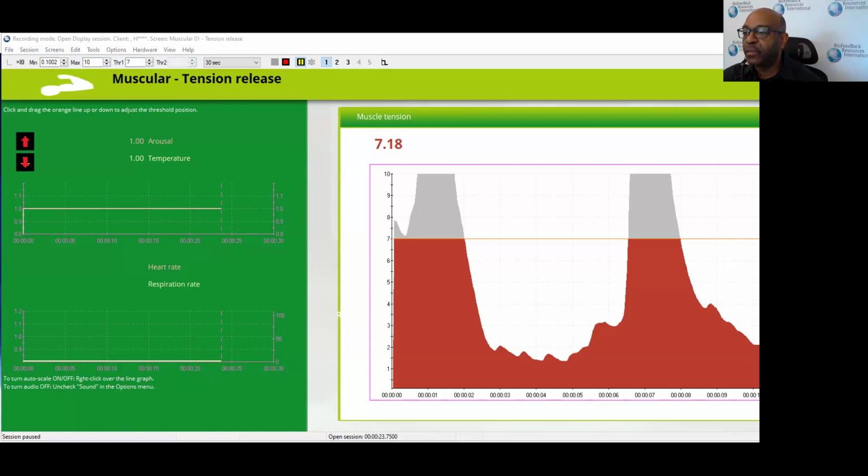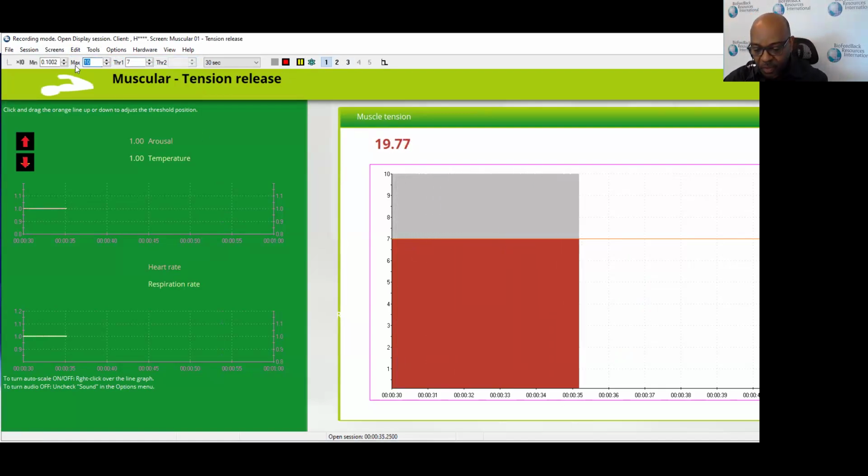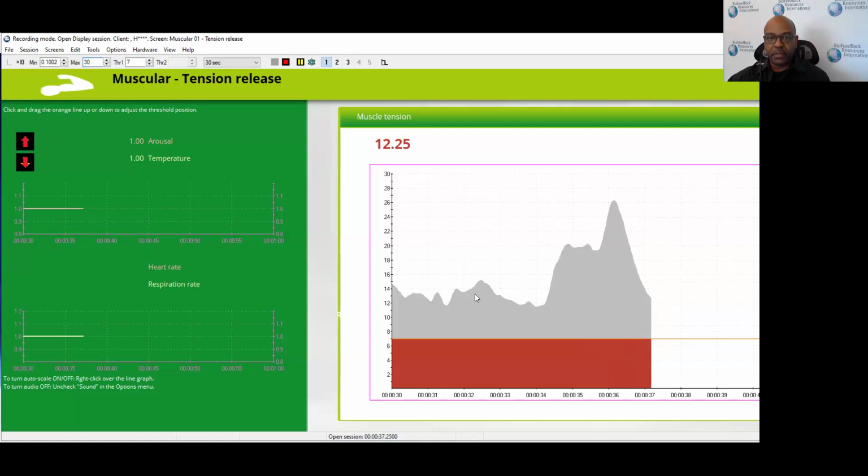Yeah, so it's set to 100 to 500, which is pretty good. I'm going to just leave it there. We could play around with the filter to get it to be less than that, but for the purposes of the demonstration, I'm not going to fool with it anymore. So I'm going to change the scale. So instead of 0 to 10, let's make it 0 to 30.